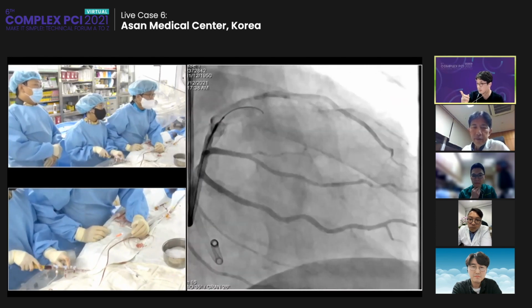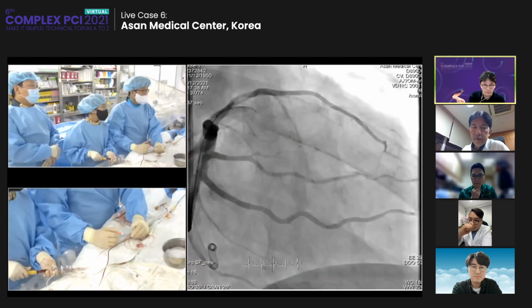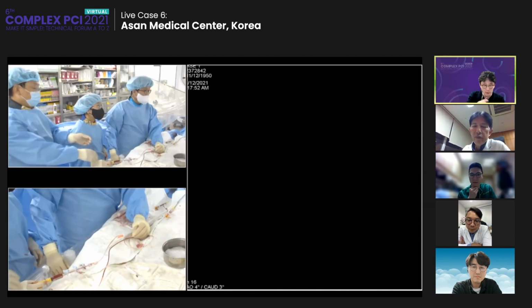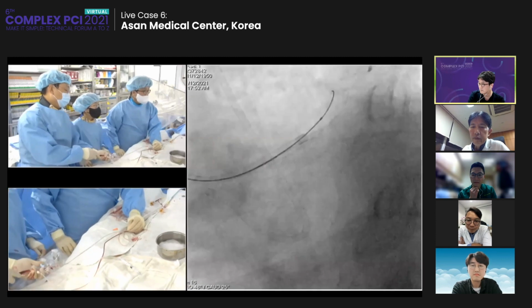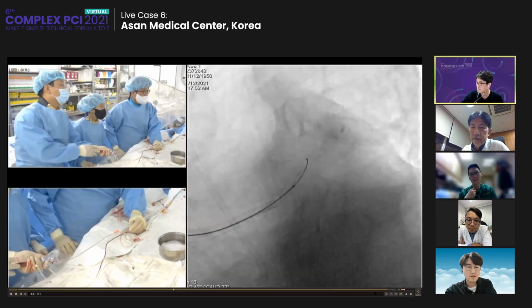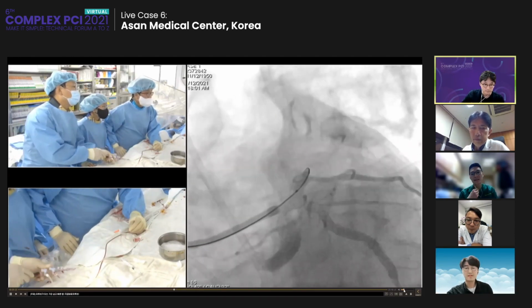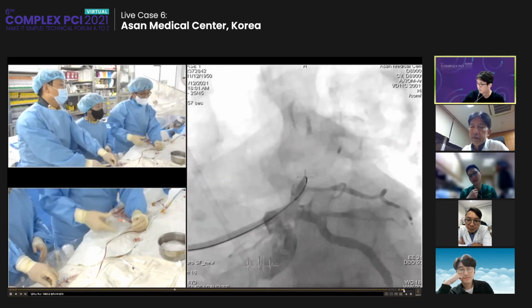So you see that this wire is at the tapered portion in the cranial view, and I wired this point according to our CT finding. Okay. Dr. Pyramid, this wire is Gaia Second. It has to go right at the 1 o'clock direction.